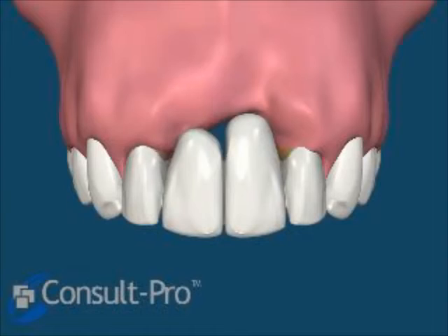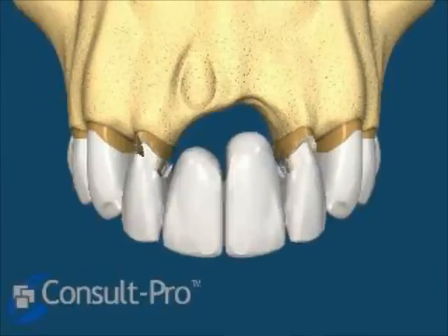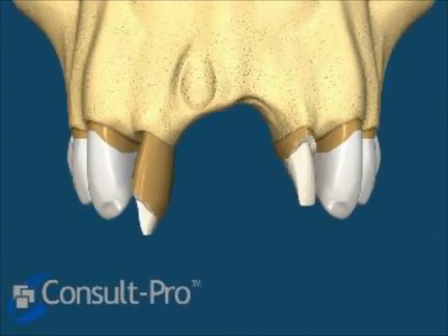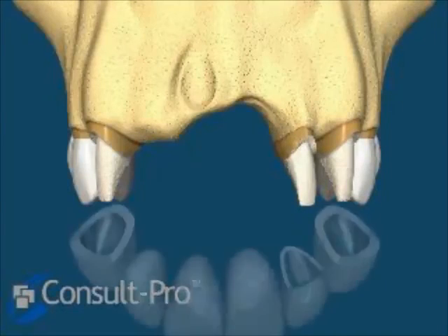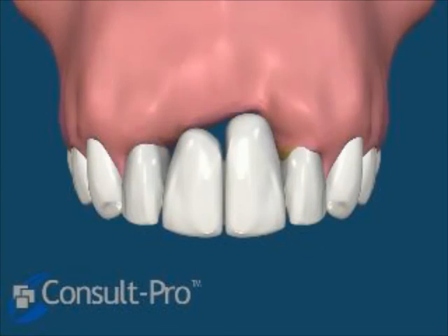This can eventually lead, because of the weakness of these 2 lateral incisors as abutment teeth, to further problems and of course further recession in the area of the central incisor pontics. If we lose the lateral incisor due to tooth loss or fracture, we now end up with a worsening of this condition that leads on with more tooth loss and more destruction, eventually going to a 6-unit bridge. So you can see implants are certainly the better option whenever possible to save your teeth.